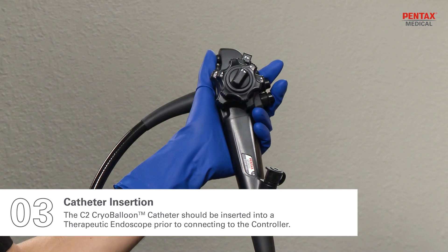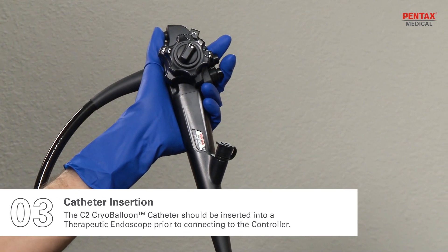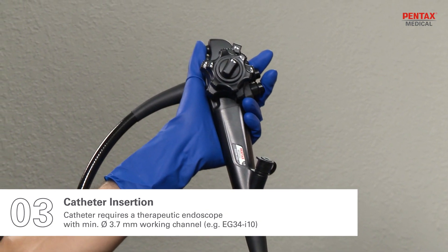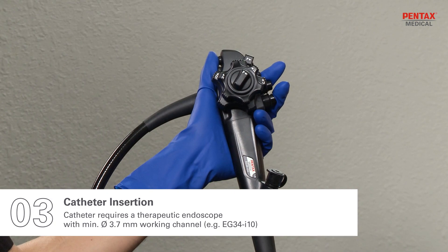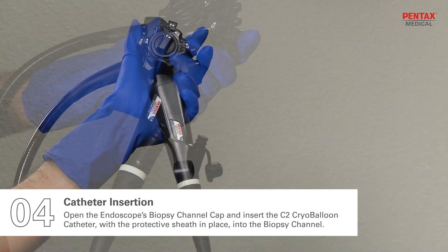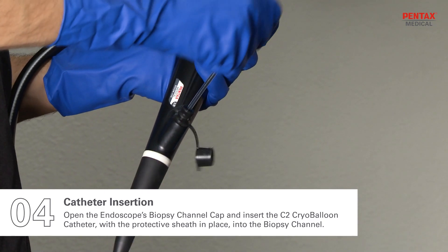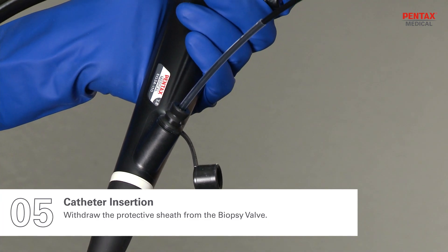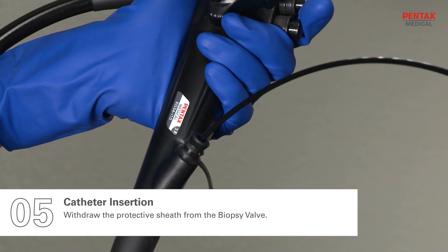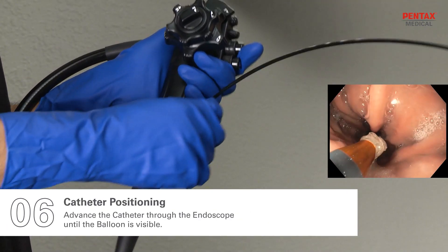The C2 cryoballoon catheter should be inserted into a therapeutic endoscope prior to connecting to the controller. Open the endoscope's biopsy channel cap and insert the C2 cryoballoon catheter with the protective sheath in place into the biopsy channel. Withdraw the protective sheath from the biopsy valve. Advance the catheter through the endoscope until the balloon is visible.